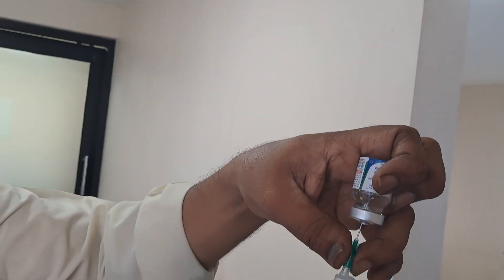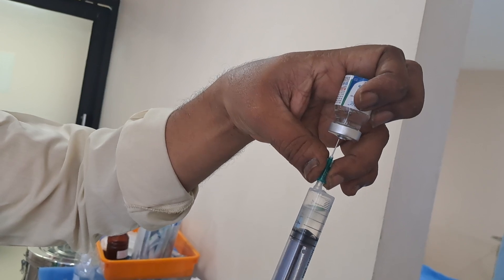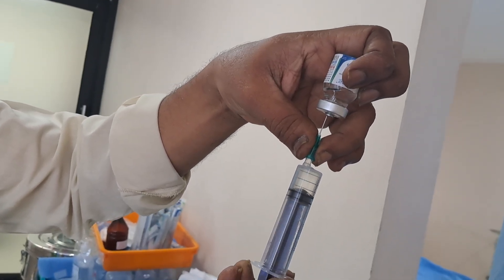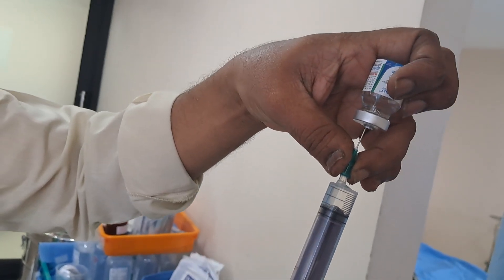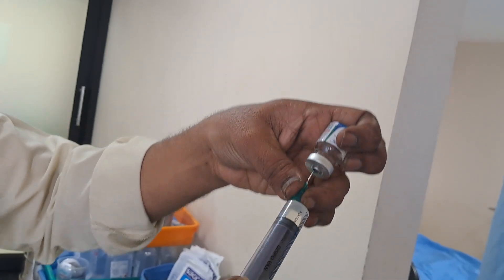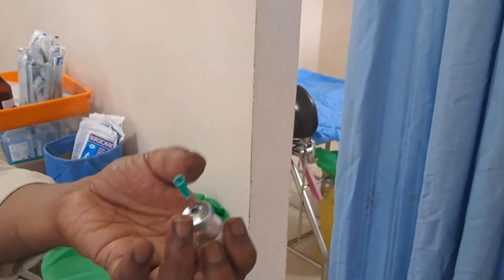It will not jump inside. After injecting water for dilution and after shaking, you need to equalize the pressure by keeping the needle tip above the liquid level. Just listen — you can hear the sound coming, which means the pressure is equalized.